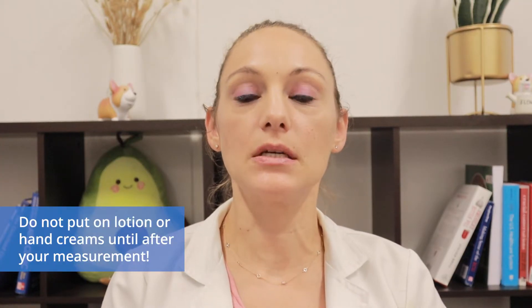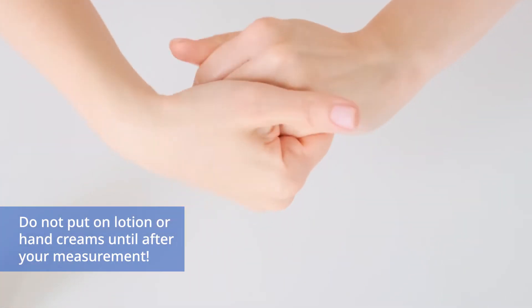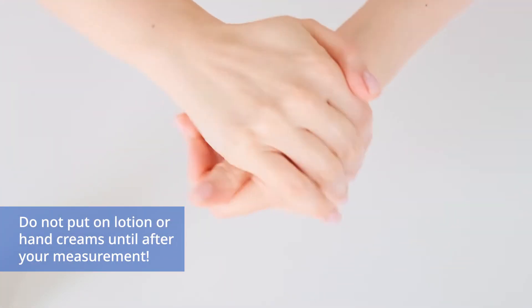Do not put lotion or hand cream on your hands until after your measurement is done. Lotions and creams leave a residue leading to extra high or low readings.